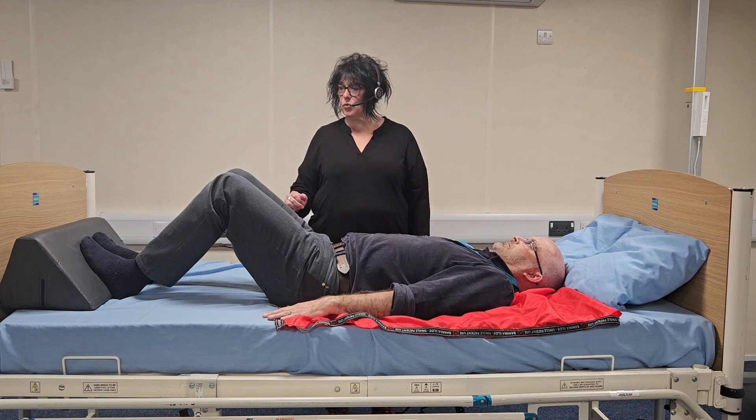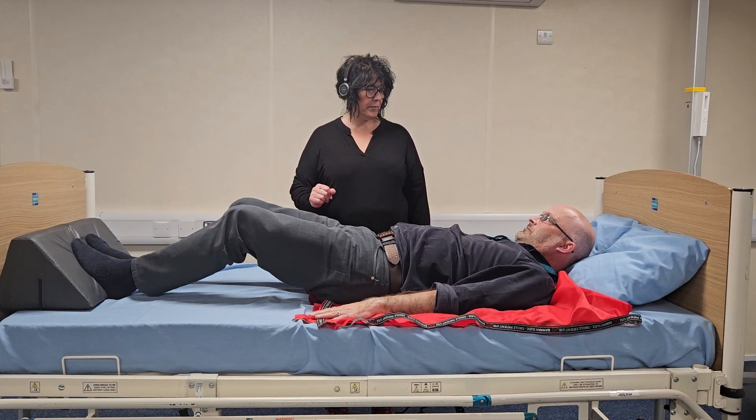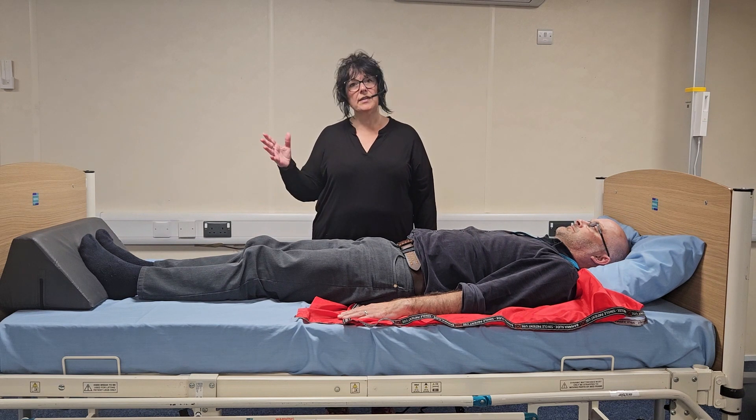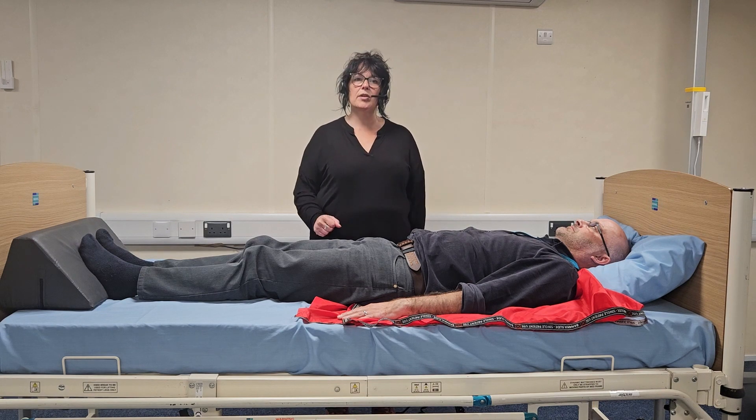So when you're ready, if you can bridge and push through your legs and push yourself up the bed — simple as that. At this stage we would remove the positioning wedge and the slide sheets, and then the person is ready for bed.